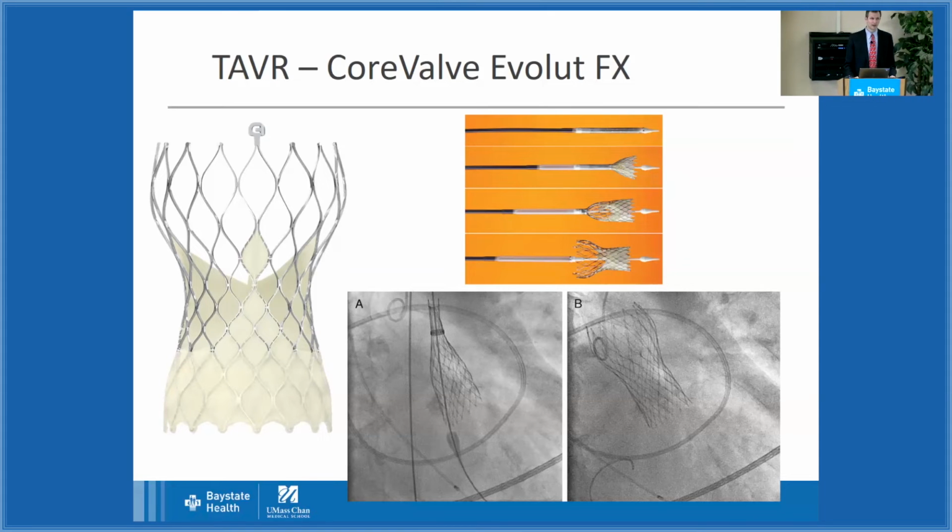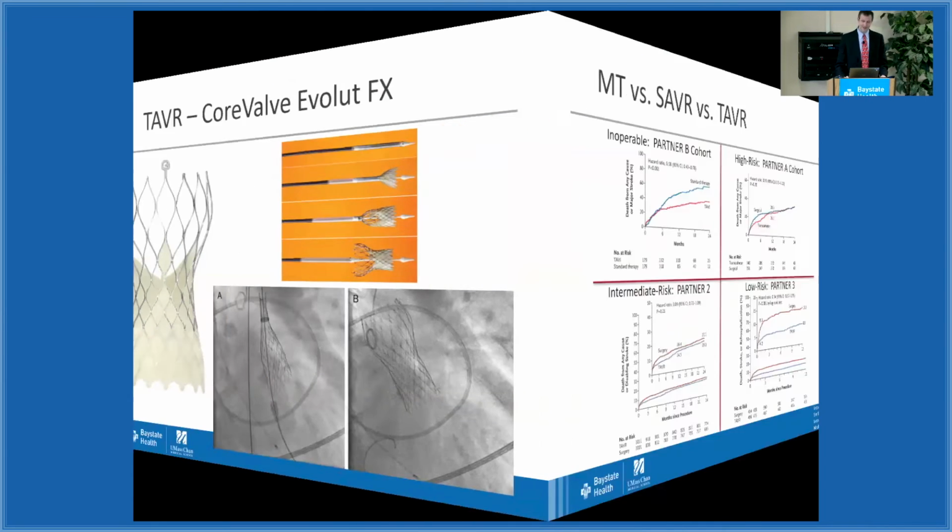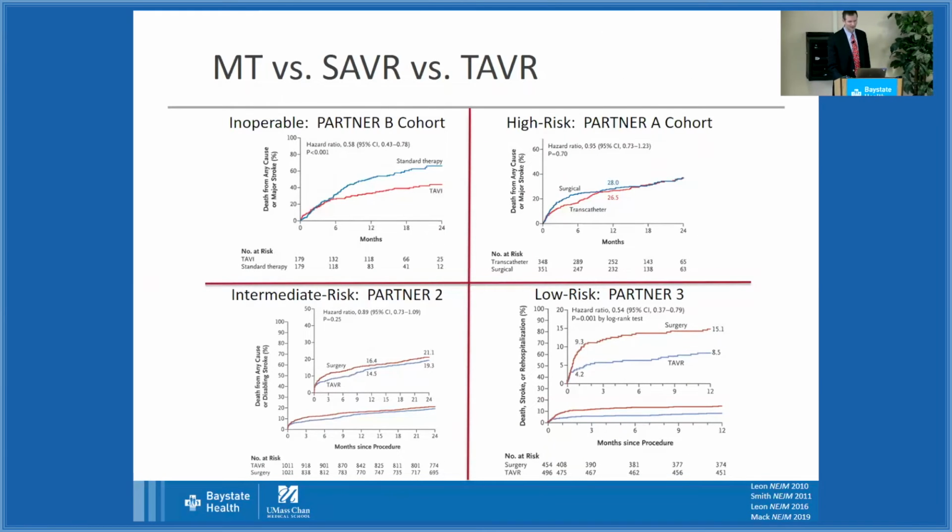Okay. Now you've been through this before, right? I know what you're going to ask me. Does this really work? Yeah, it does. And there have been a lot of trials of this one. I'm not going to go through all the details in all these trials. You can see that there are a bunch of red and blue lines. And suffice it to say that there have been trials done in people who are absolutely not surgical candidates.